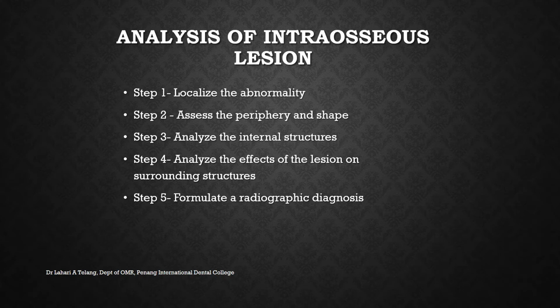To analyze intraosseous lesions, there are certain steps that have been laid down. Step 1 is to localize the abnormality. Step 2, to assess the periphery and shape. Step 3, to analyze the internal structures. Step 4, analyze the effects of the lesion on the surrounding structures. And step 5, finally, to formulate a radiographic diagnosis. So following this 5-step method would be easy to go about any radiographic interpretation of a lesion that you're looking at on a larger radiograph or a smaller radiograph.